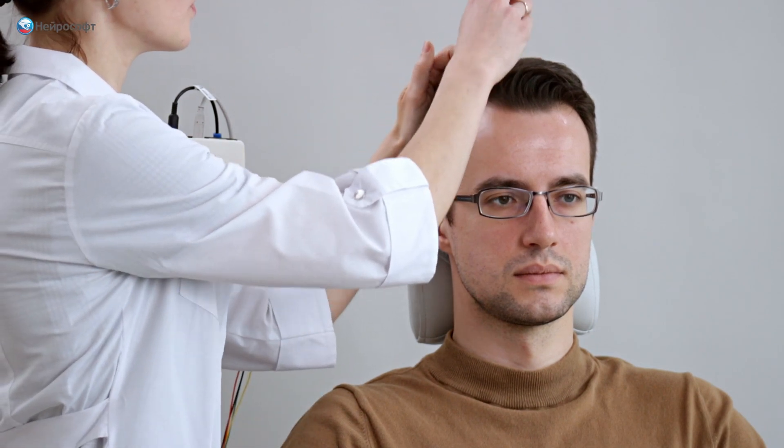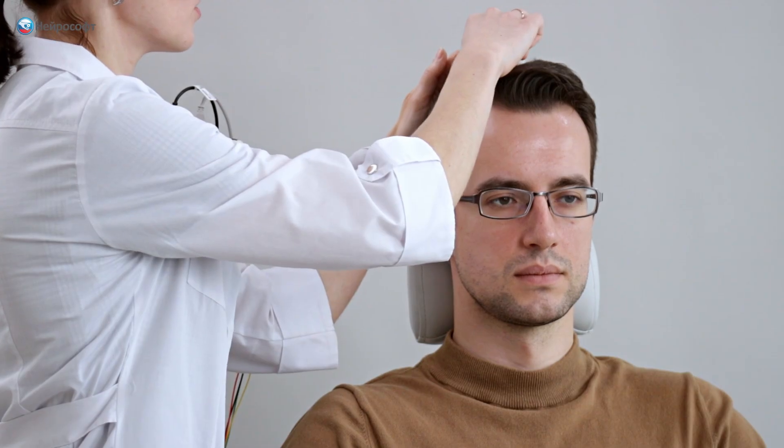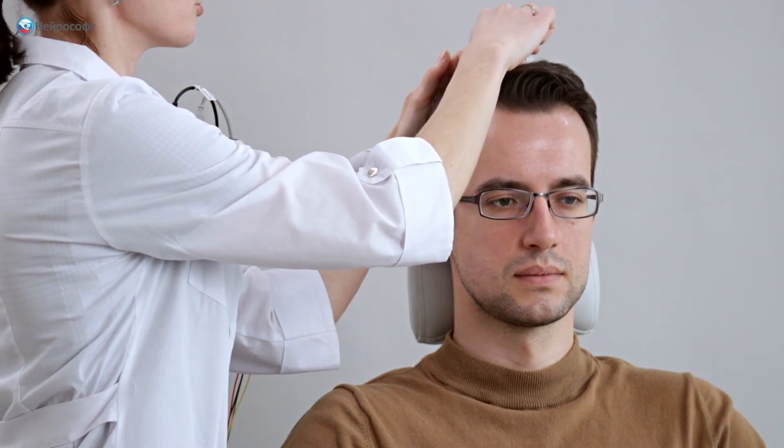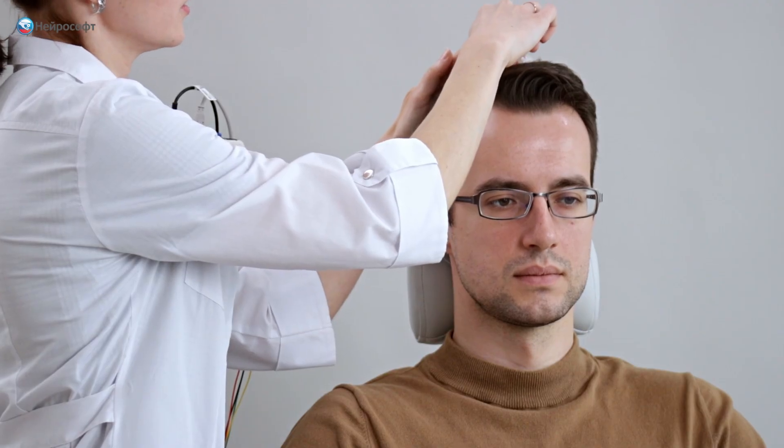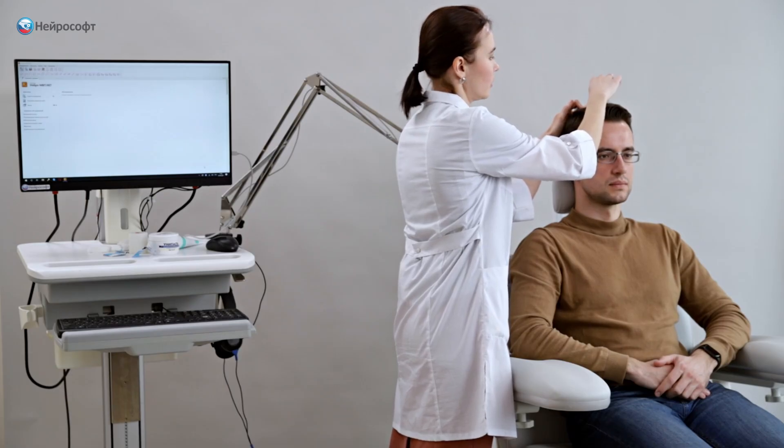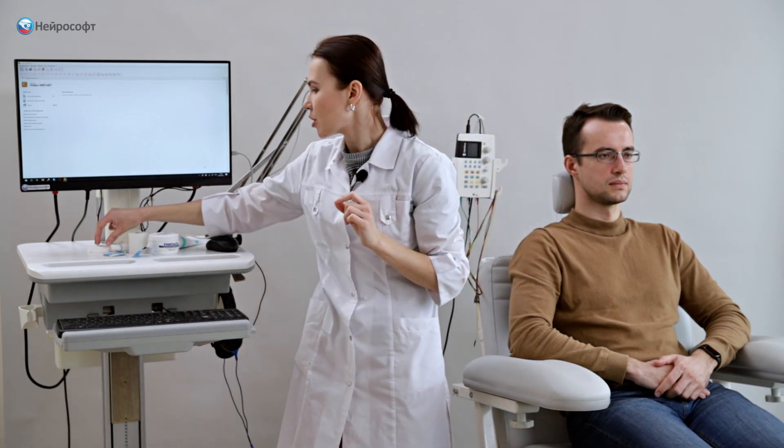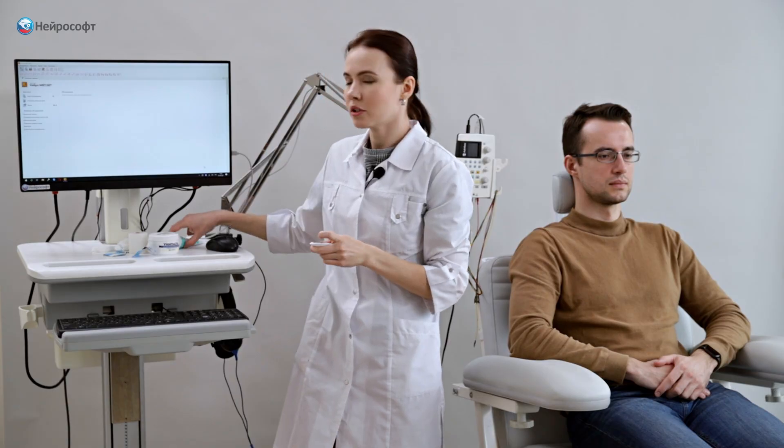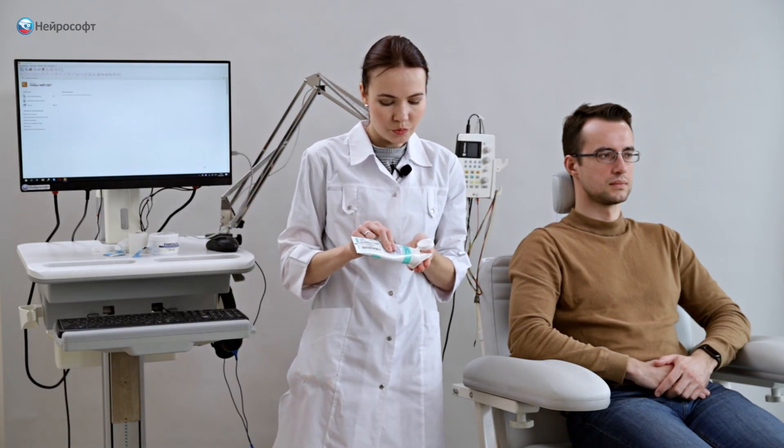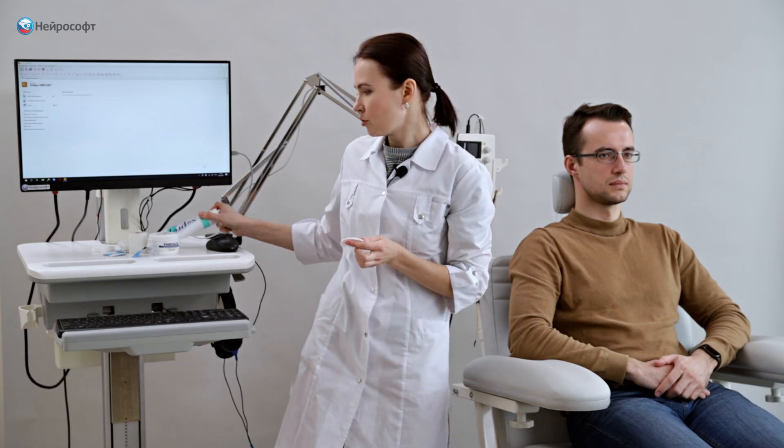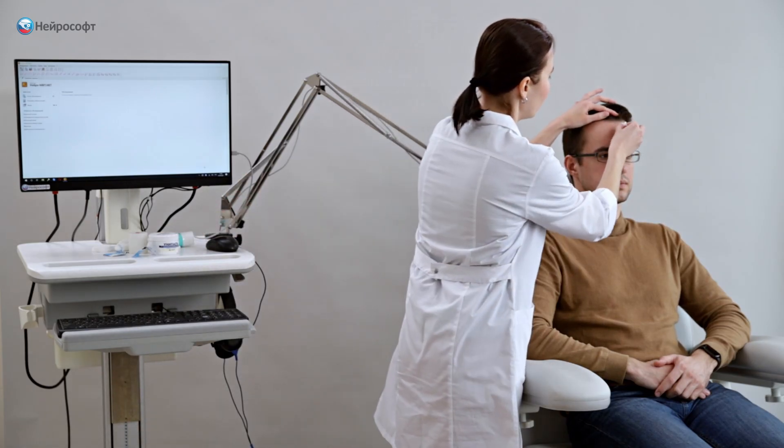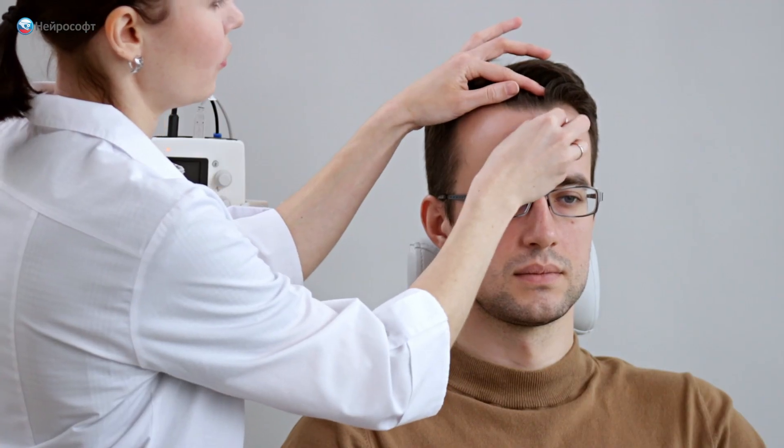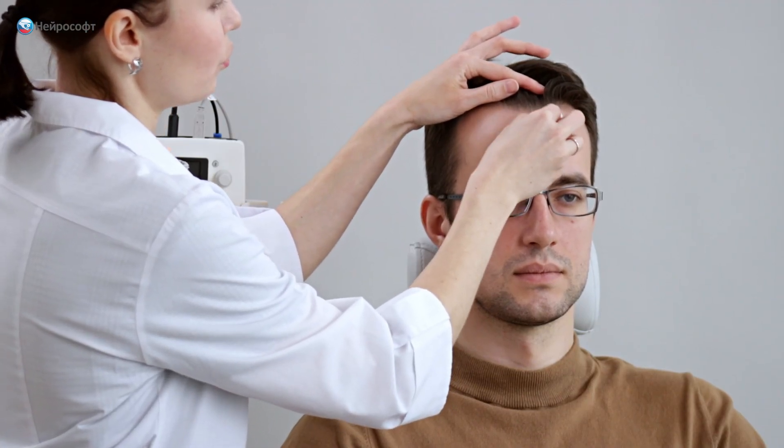We clean the skin of the scalp with an alcohol wipe. Then proceed to treat these points with an abrasive paste. We need the abrasive paste treatment in order to exfoliate the skin in these areas and to reduce the level of subelectrode impedance in these points when positioning the electrodes. We clean until slight reddening of the skin in these areas.